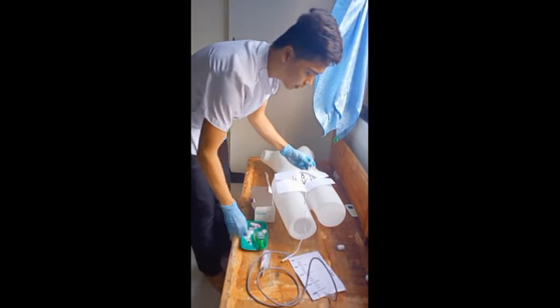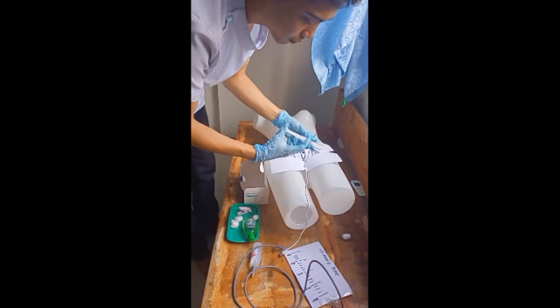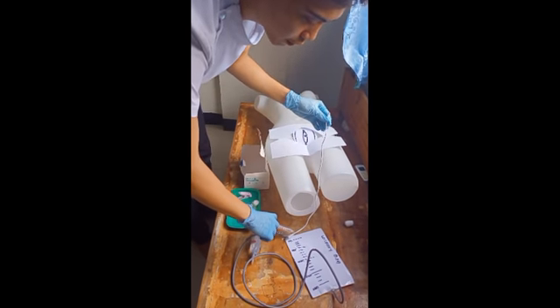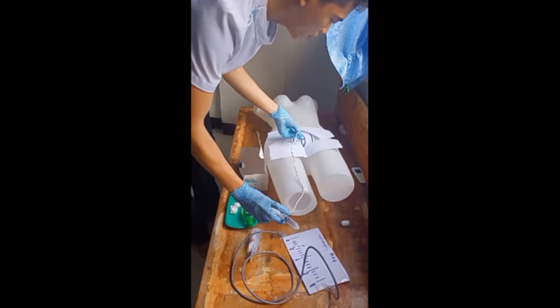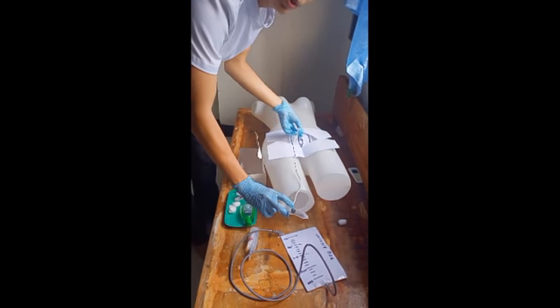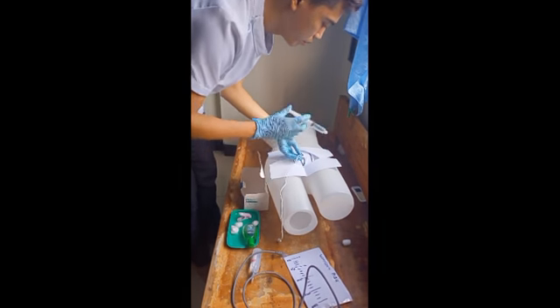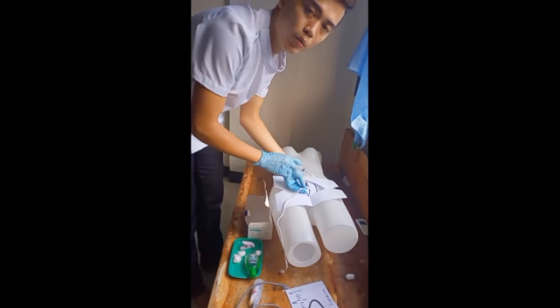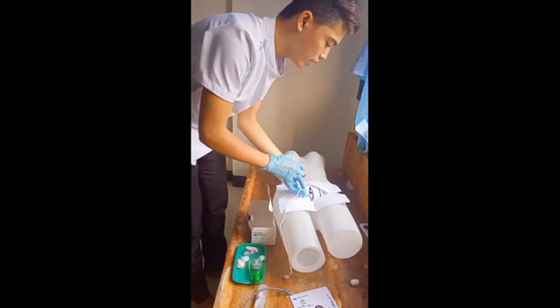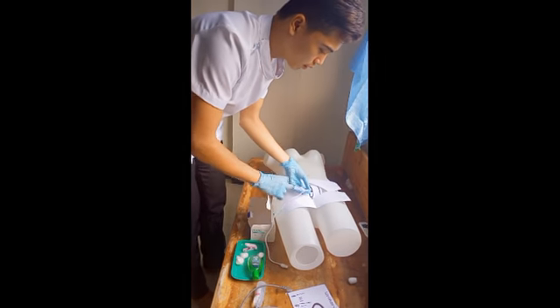The next is I'm going to insert this urinary catheter inside the urethra of the patient, okay?